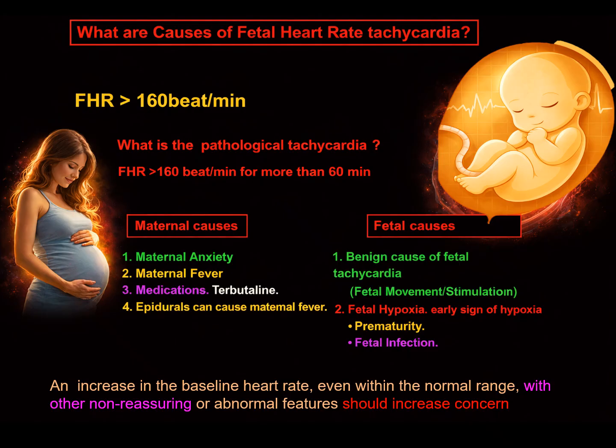What could be the possible causes of fetal heart rate tachycardia? Before we talk about fetal heart rate tachycardia, we have to define it. It's more than 160 beats per minute, lasting for more than 60 minutes. If it lasts for more than 60 minutes, it's not amber, it is pathological.